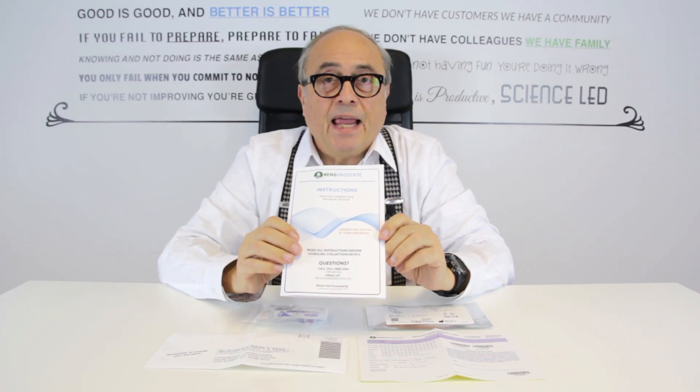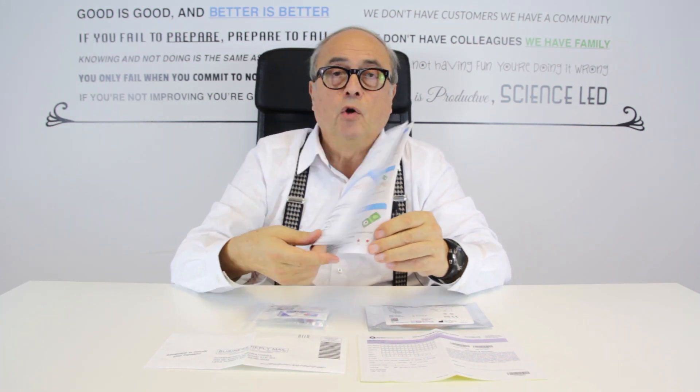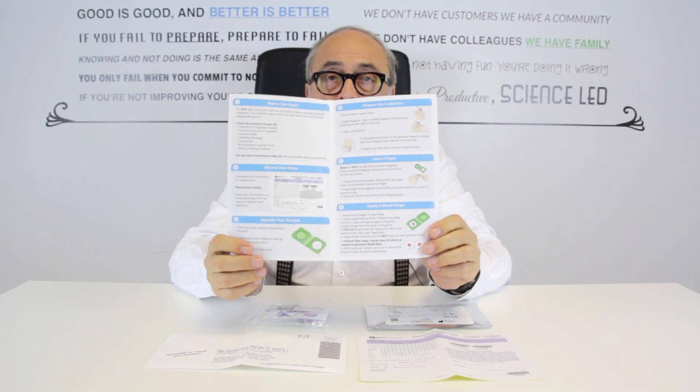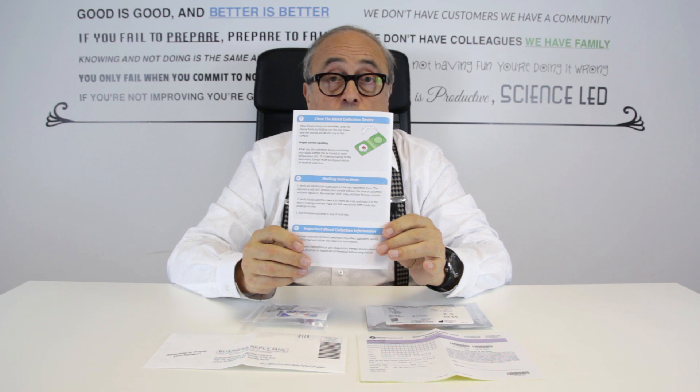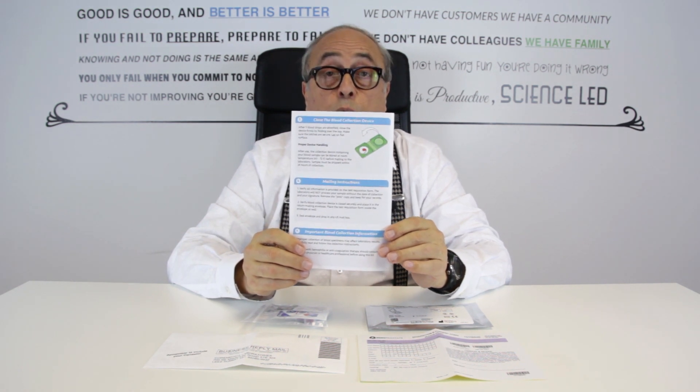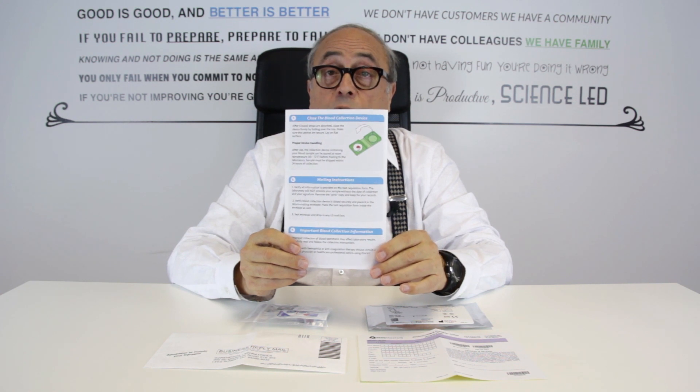So what's in your PSA blood test kit? The first thing you'll see is a full colour booklet which contains all the steps you need to know in order to do the test. It's very simple to use and read, but it's important that you read it properly in order to make sure that you do get your accurate result.